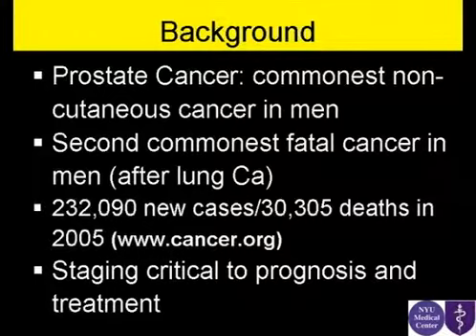The staging, of course, is critical to any treatment decision and also critical for prognosis indicators. Most urologists will not use MRI because it's fairly poorly accessible or expensive. They will probably do staging using clinical criteria, but MRI is extremely helpful in terms of making decisions for treatment of prostate cancer, as you may see in the presentation.